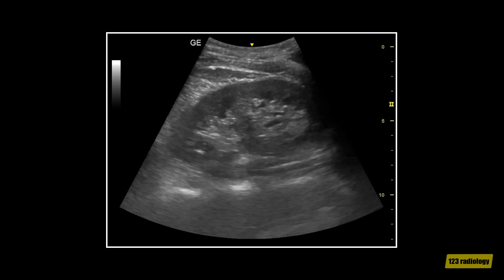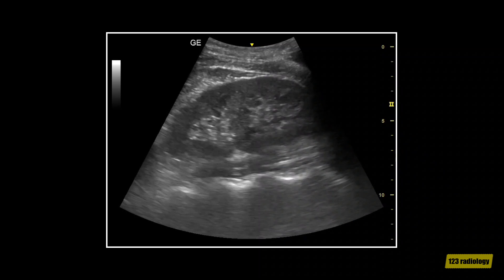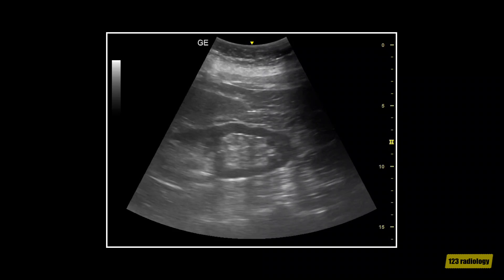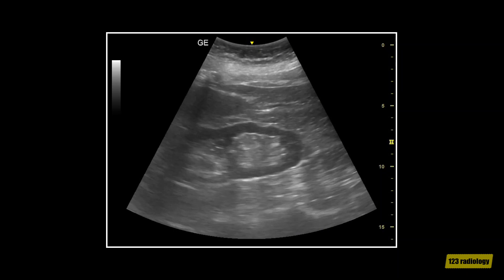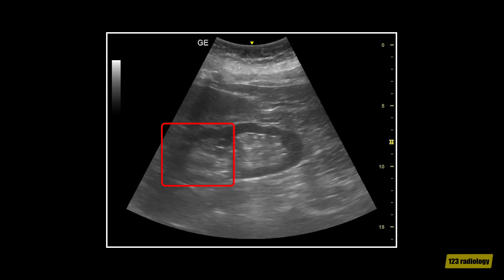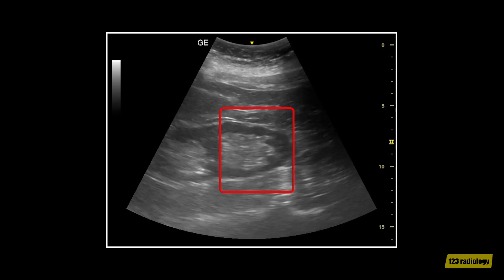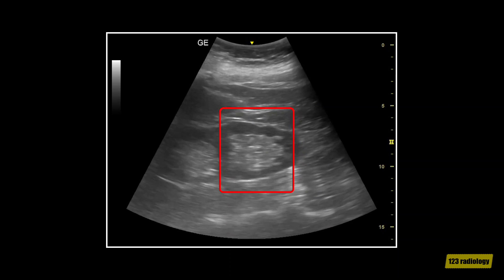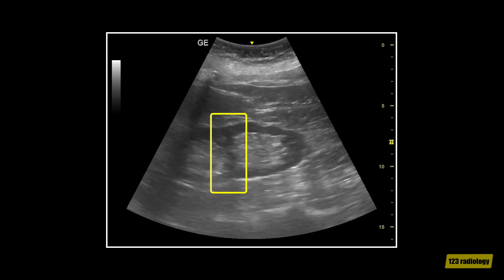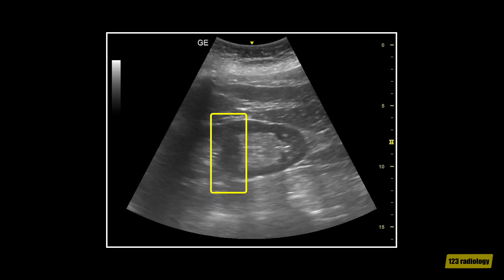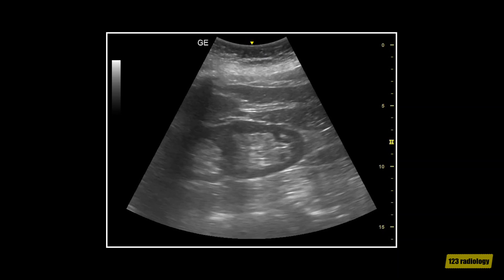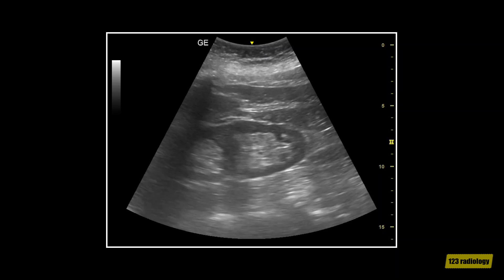No evidence of hydronephrosis in either moiety. This is another case of duplex kidney. This is the upper moiety and this is the lower moiety. There is no hilar fat in the mid-pole of the kidney, with a complete band of renal tissue separating the sinus fat into two compartments.